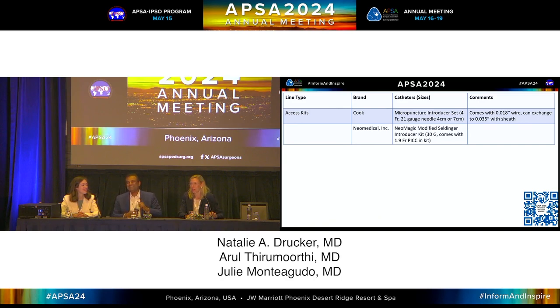Great session. Do you mind commenting on your fixation of the lines? Use of glue at exit sites, tape devices, StatLocks, sutures. Comment on your fixation. I would venture that I speak for all of us when I say we suture them. We suture everything, tie it everywhere. That's what I would say. I mean, you can put dressings over it, but everything's got to be secure.